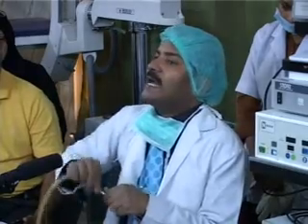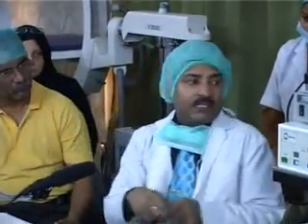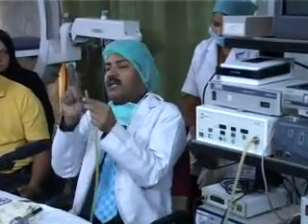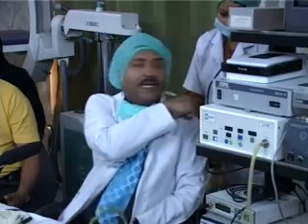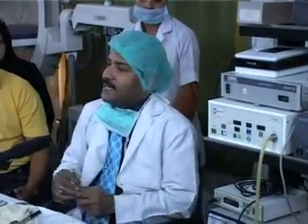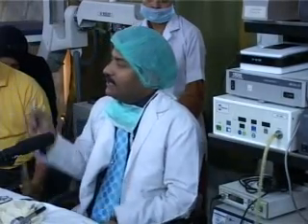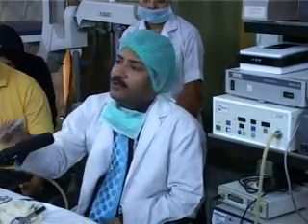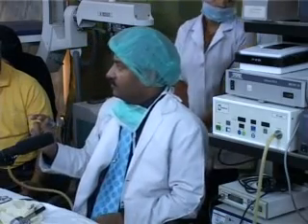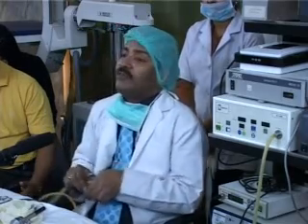Suppose overnight I have not used this insufflator, this tubing was sterilized, this insufflator was sterilized. Now the amount of air starting from this tip up to the cylinder is 800 ml, and that 800 ml of air is sufficient to kill your patient if it inadvertently goes into the vein, because it will immediately create an air embolism. That's why in the insufflator there is one safety feature.